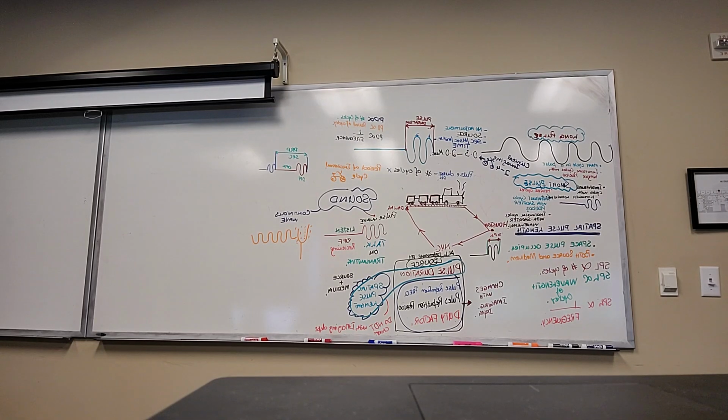You change the imaging depth, you change the PRP. You're scanning the pancreas, which is superficial, and now you're scanning the kidney, which is deeper. So what did you change? Imaging depth. And you have the capability to change it, so it is adjustable.